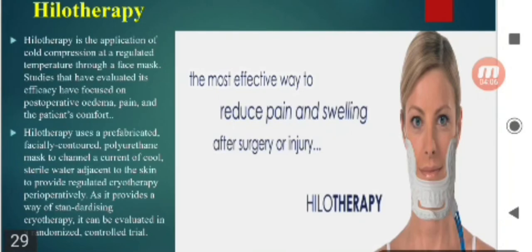Now we have hilotherapy. Hilotherapy is the application of cold compression at a regulated temperature through a face mask. Studies that have evaluated its efficacy have focused on postoperative edema, pain and patient comfort. Hilotherapy uses a prefabricated facial contoured polyurethane mask to channel a current of cool, sterile water adjacent to the skin to provide a regulated cryotherapy.